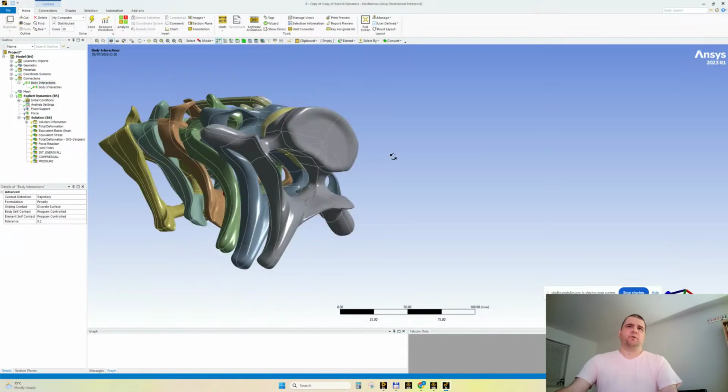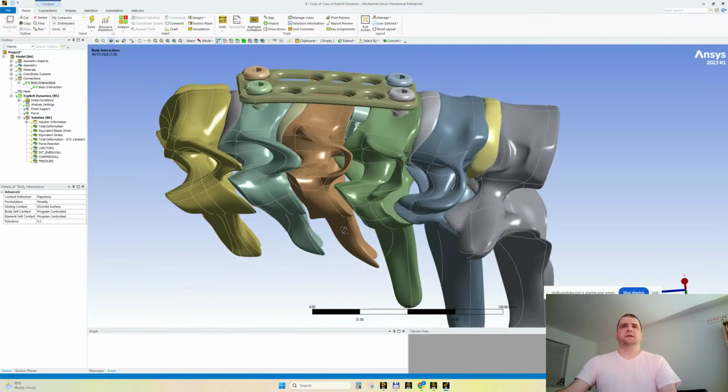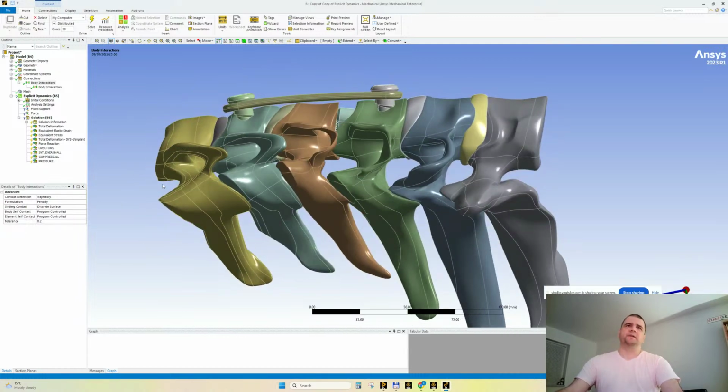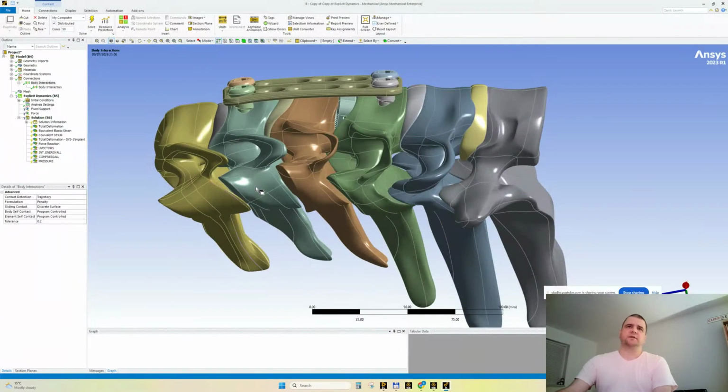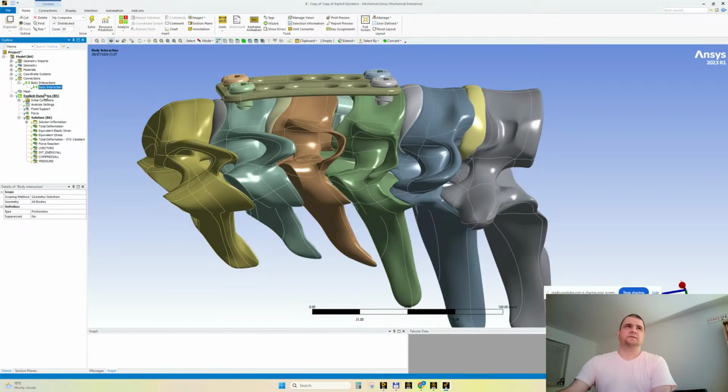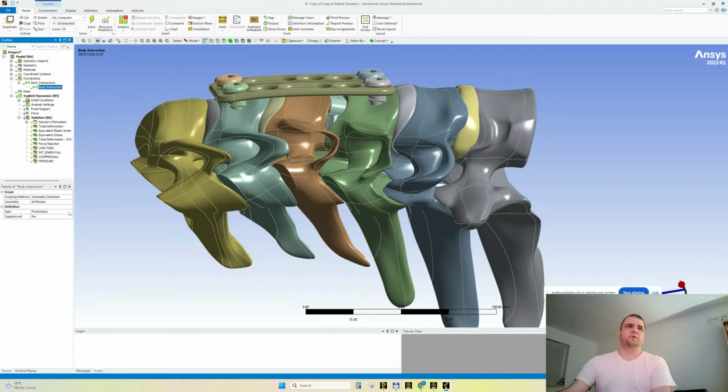All right. There is a small problem here, so something to be taken into account. If the compression force plus the moment are too high, then there will be a touching here. My first thought was to make all bodies bonded.